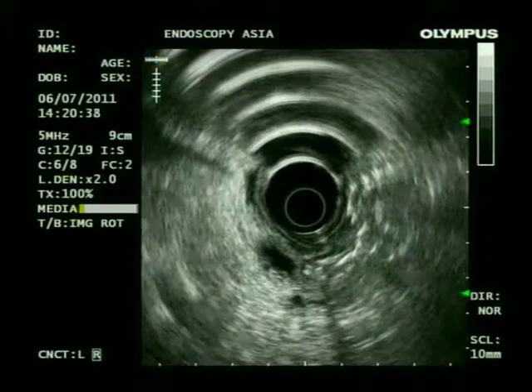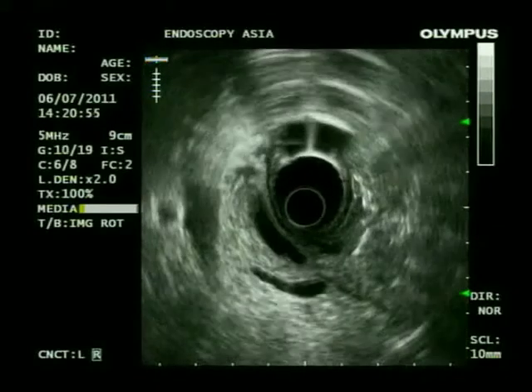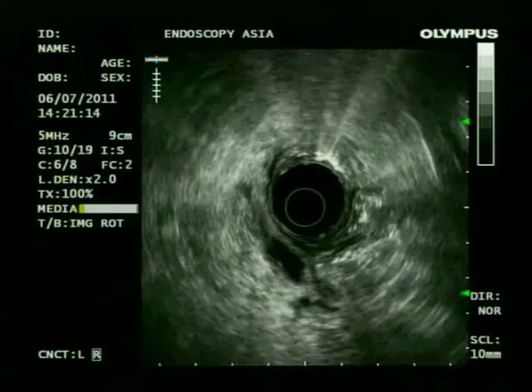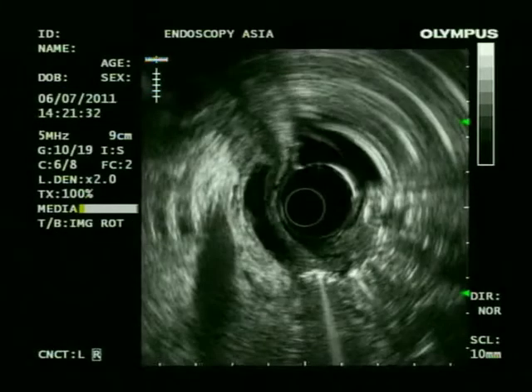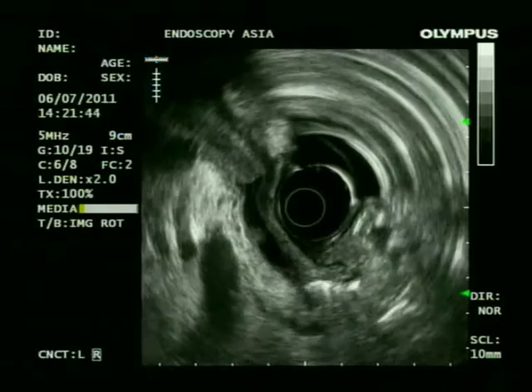A 70-year-old male was referred to us for evaluation of etiology of obstructive jaundice. Patient has severe icterus and severe cholestatic symptoms, and with 15% ejection fraction, very poor risk for surgical procedures, and therefore was evaluated with endoscopic ultrasound.